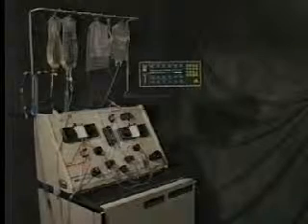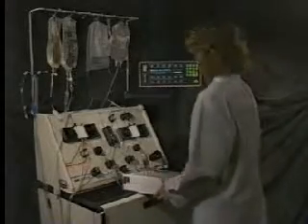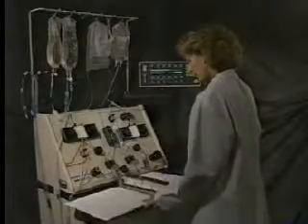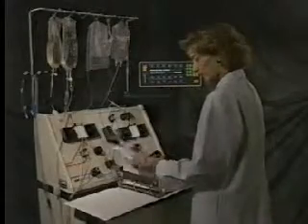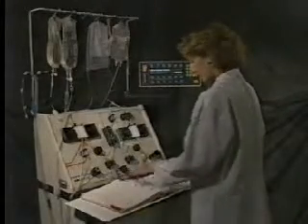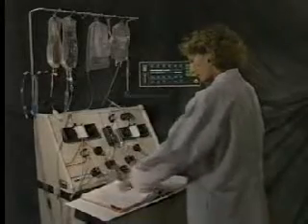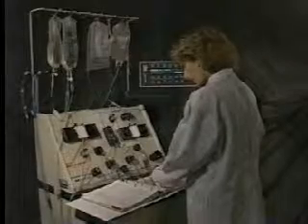Our next step is troubleshooting. The Cobe Spectra has a built-in safety system that signals you with an alarm when the system enters a warning condition. Becoming familiar with how the alarms sound, how they look, and what they mean will make a big difference in your ability to stay calm and troubleshoot the problem efficiently. Let's begin by becoming familiar with the different types of alarms.